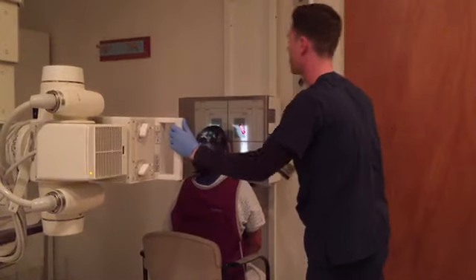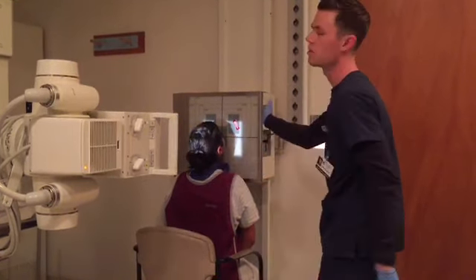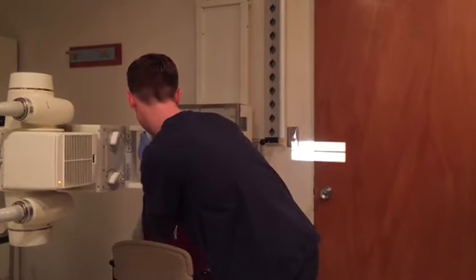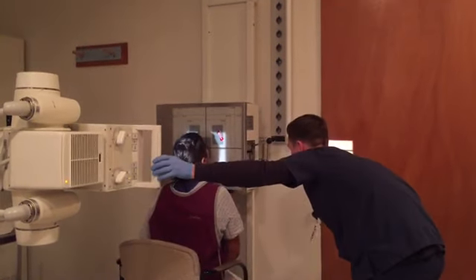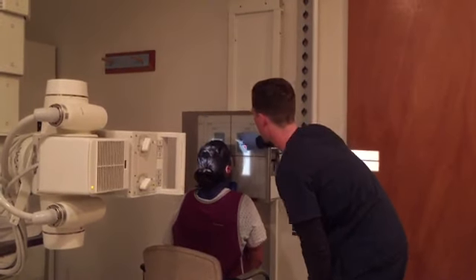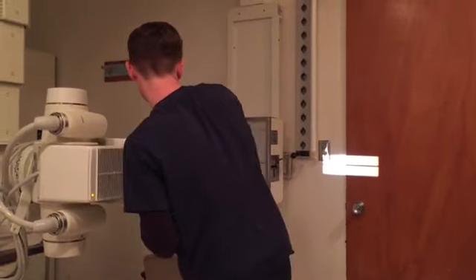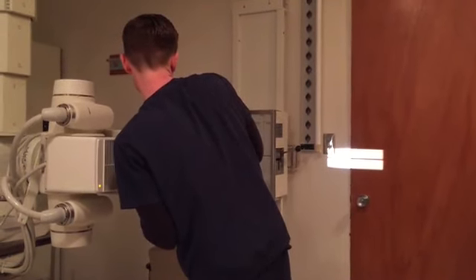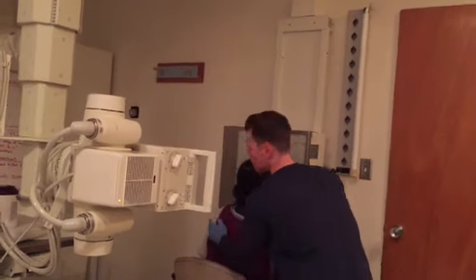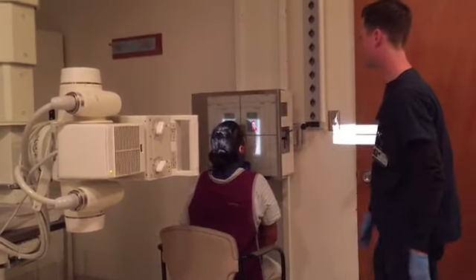The central ray for this one exits at the acanthion, with the mid-sagittal plane perpendicular to the IR, of course. So, we're pretty much lined up right here. I have my marker on the right side. Collimate down. Actually, move a little bit to your right. Right there. Perfect. My bucky's lined up.